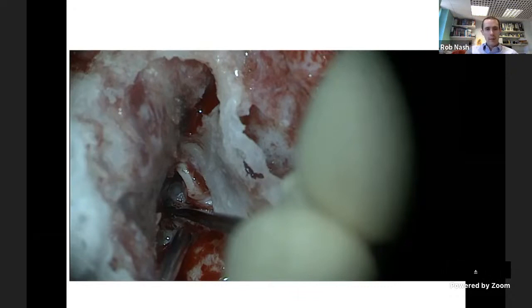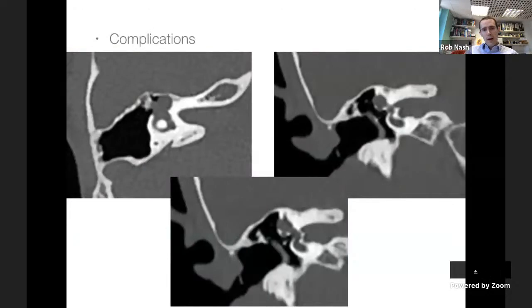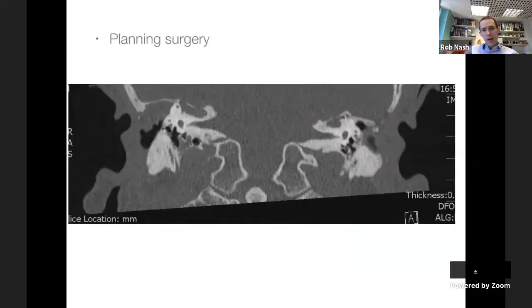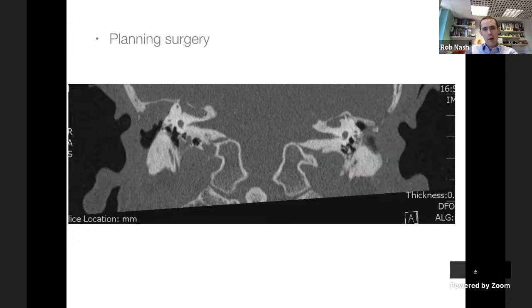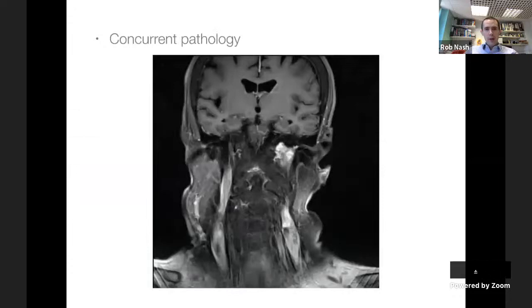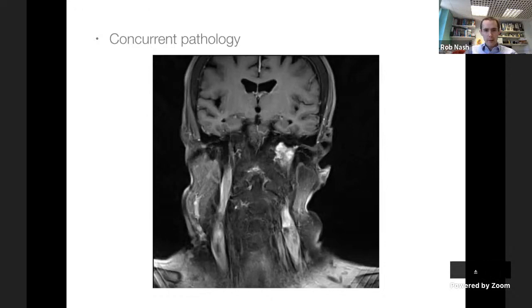Surgery for this patient involved removing much of the tegmen - you can see the dura of the middle fossa on the left, the ear canal on the right. By removing the tegmen and elevating the dura, the view into the inner ear was significantly improved. Another example of pre-operative imaging for surgical planning: a patient whose cholesteatoma extends over the superior semicircular canal towards the petrous apex - this radically changes the surgical plan.